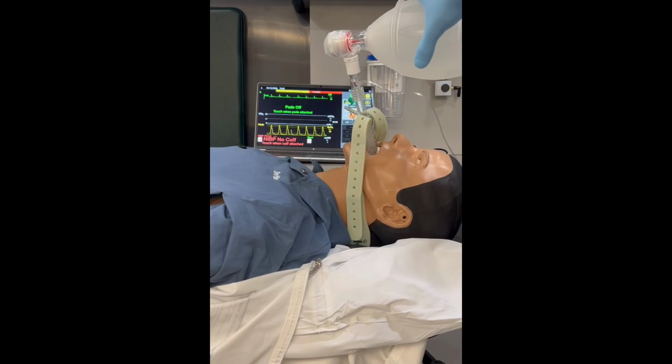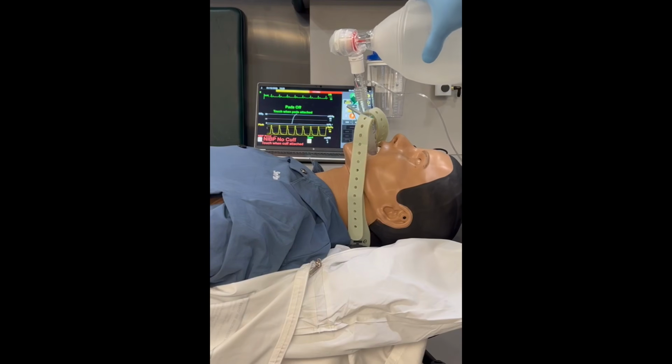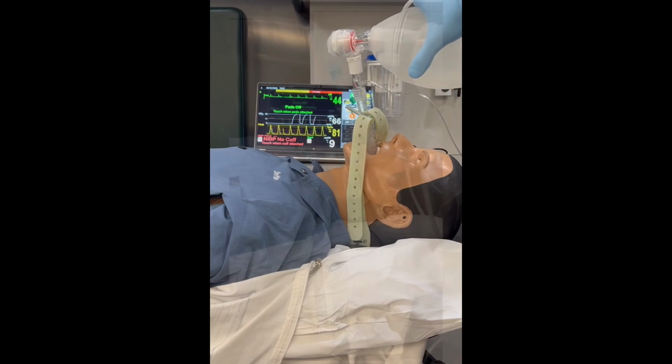In this clip, we see a patient being ventilated with a supraglottic airway, and in the background on the monitor, we can see low oxygen saturation with a shark fin waveform on the capnography. To help this patient improve ventilation and oxygenation, we should administer inline nebulized medication such as albuterol and Atrovent, or as your local protocols dictate.